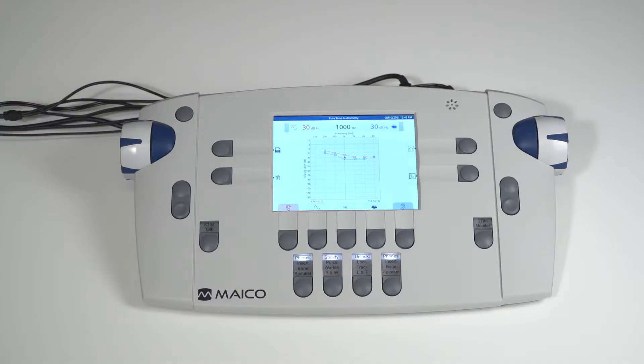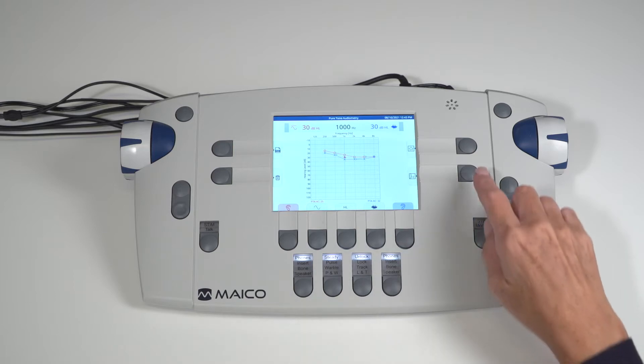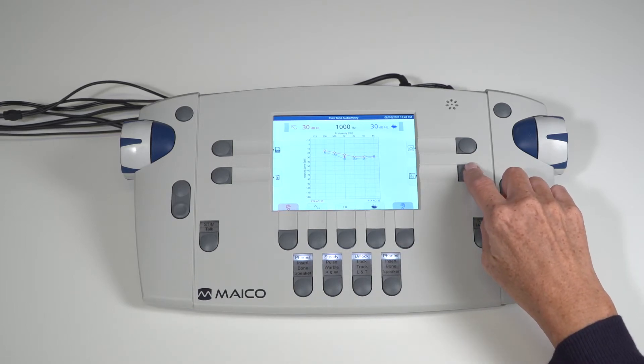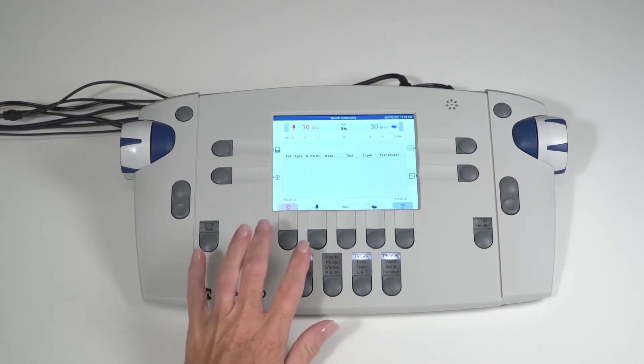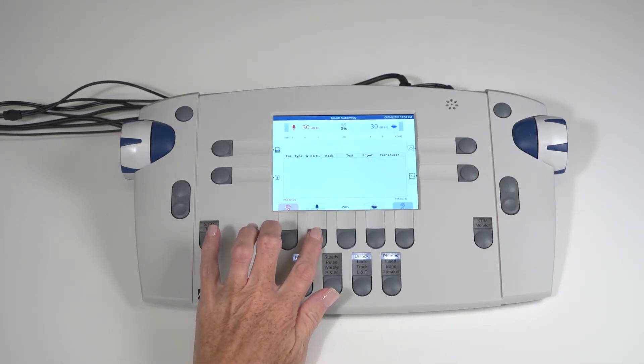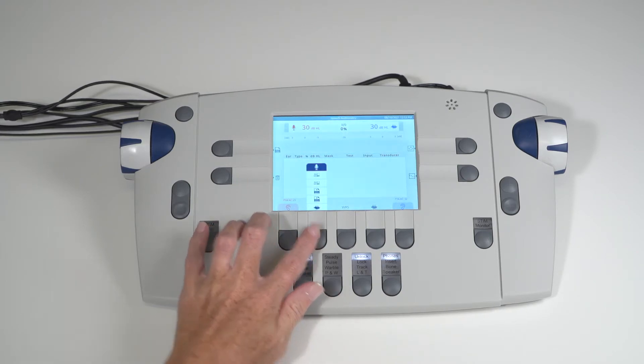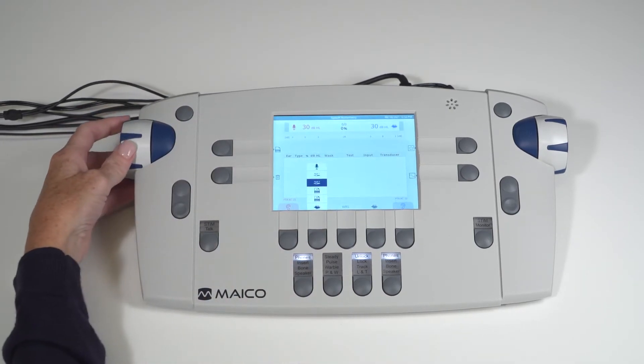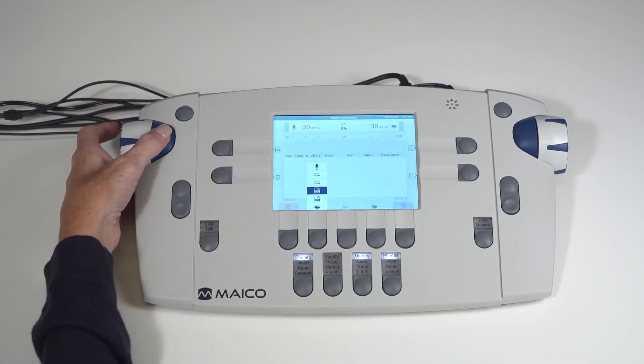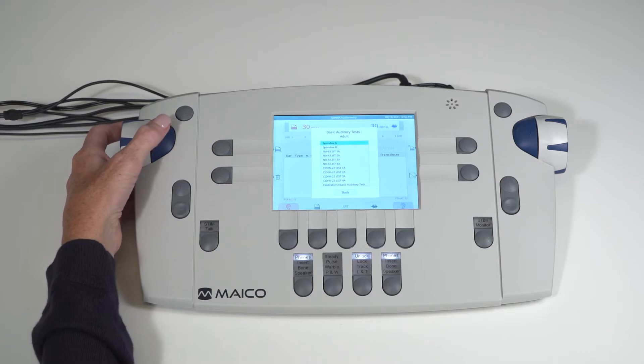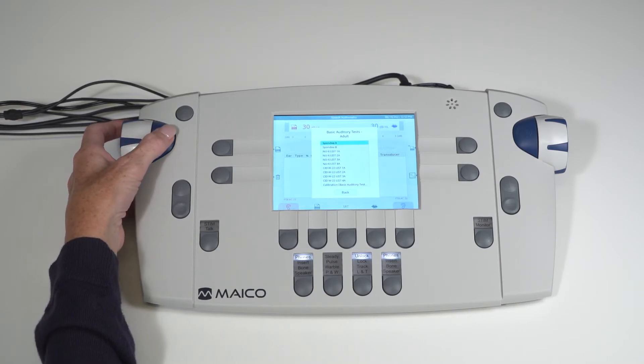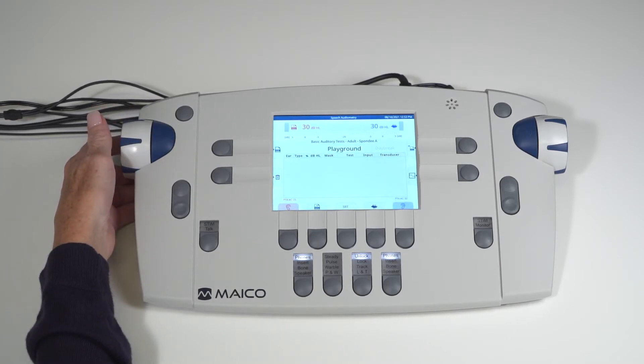Wave files are stored speech lists that are pre-calibrated and stored within the device. To conduct a speech test using wave files, select the speech screen. Then select or verify wave is selected. Wave file menu appears for wave file selection.